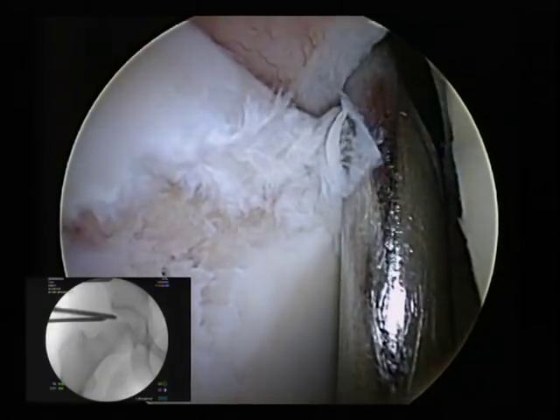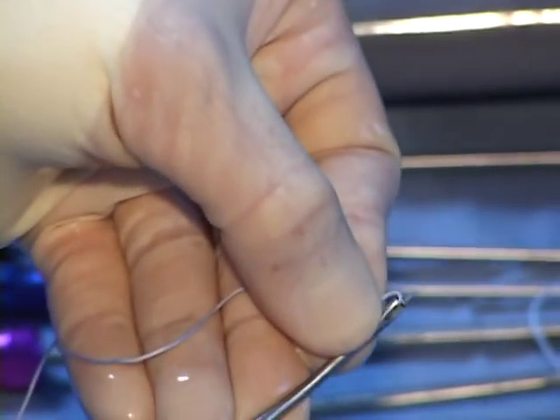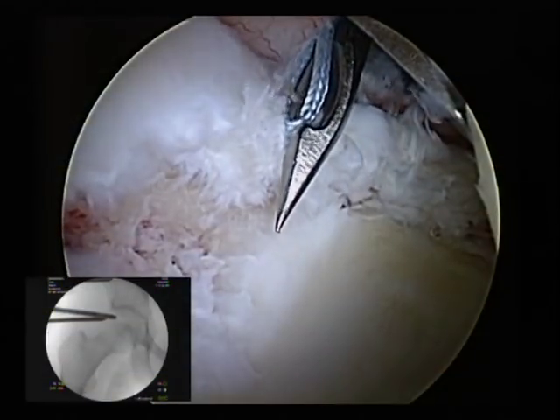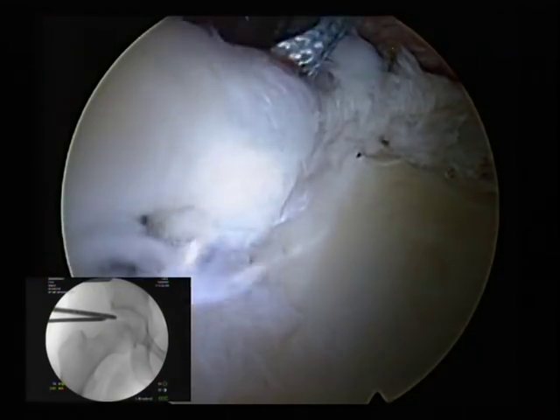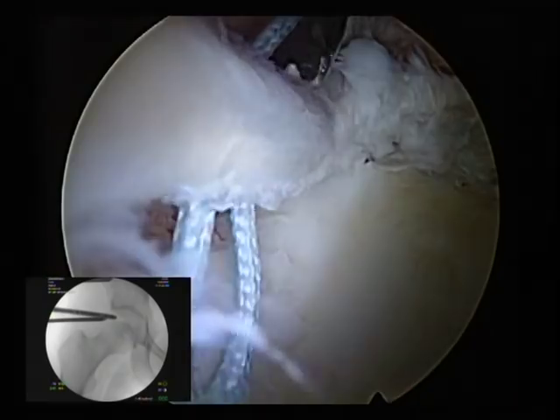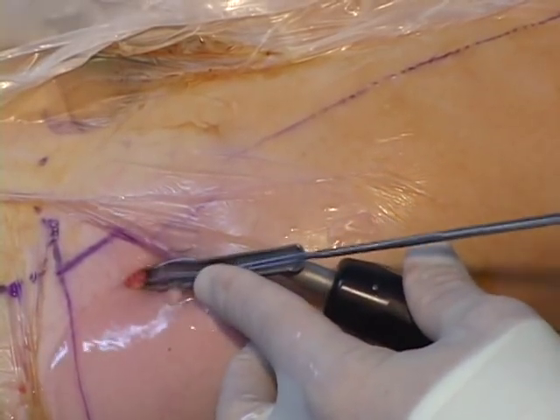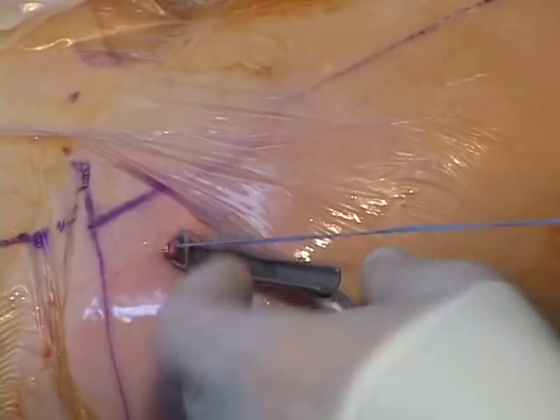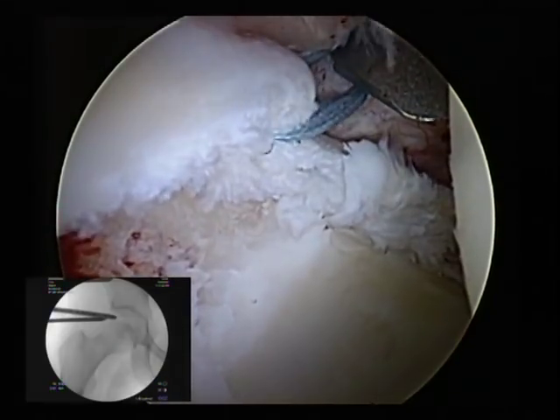We're going to reestablish the slotted cannula in position. The technique we're going to use to pass our suture will use the bird beak device. This is the loop of the suture — I've just folded it over in half, then I'll grab my loop. I want to get as much substantial tissue as I can, so I'm going to try to roll as much of that tissue back as possible. That looks like a pretty good bite. Once I've delivered some of that loop, I pull my device out and come on the articular side and grab my stitch. We'll deliver the loop outside the skin, take the two tails, pull them into the loop, and simply slide the loop back into the joint. Now we should have a nice circumferential stitch. I load the knot pusher along one of the loops in case it's hung up in any soft tissue.